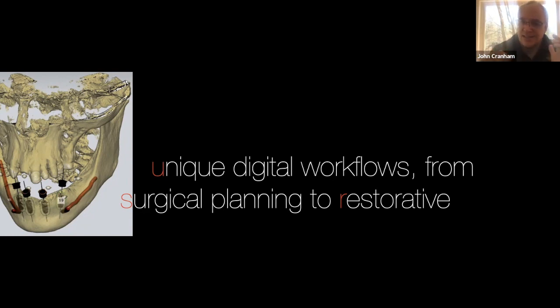So trying to scan where the alignment is. We were trying to do something anyway. It got to Lee, and they were looking at it, and they called and said there seems to be a lot of spaces between the ridge. I didn't know they struggled with the bite. So I go, no, I think it's right. Well, we get the denture back and try it, and it's open like a yard.